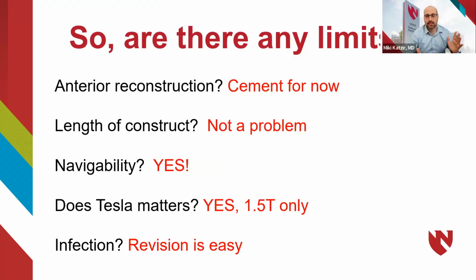Can you navigate this? Yes, I do it all the time. I don't rely on fluoroscopy because I want to have a perfect construct and not have to come back again to revise the screws. Tesla matters, yes, definitely. 1.5 only. 3 Tesla will throw you off. You will think that you put in titanium. So no, 1.5 only. Infection, it happens, unfortunately. Revision is very easy as with titanium. Wash it out. You have plastic surgery help you out with closure, wound vac, vancomycin powder, and that's about it.